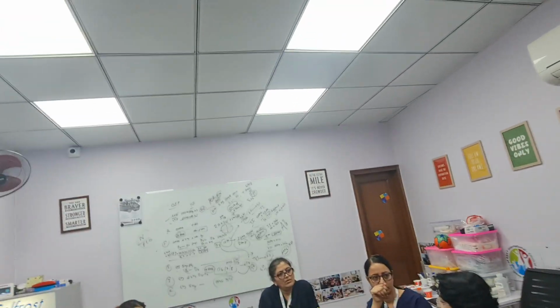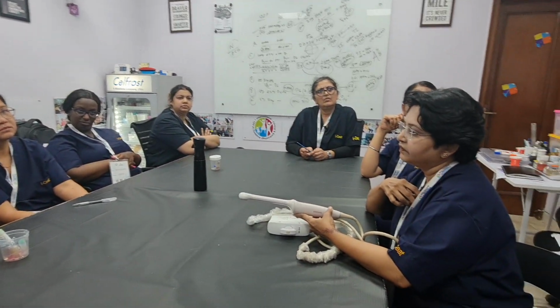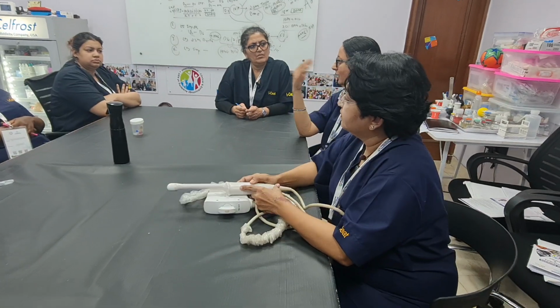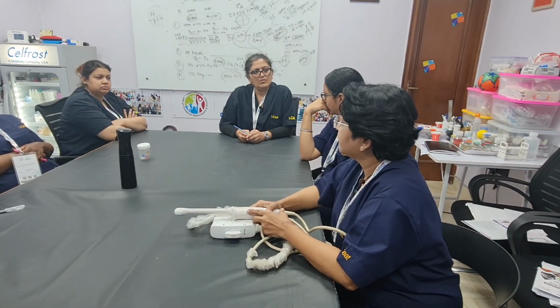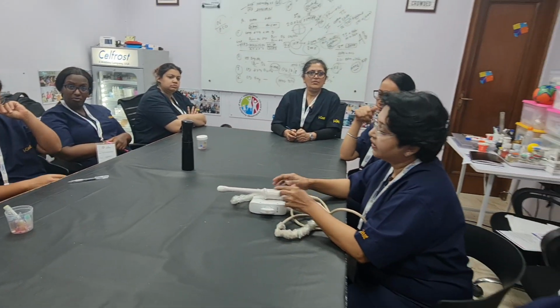Ma'am, in case she has not ovulated, do we have to cancel it? We have to wait for 3 to 4 hours. Sometimes patients ovulate then, and you get the cycle going. Sometimes in a few cases we have to do the IUI in the evening when the patient has not ovulated. Okay, after 3 to 4 hours.